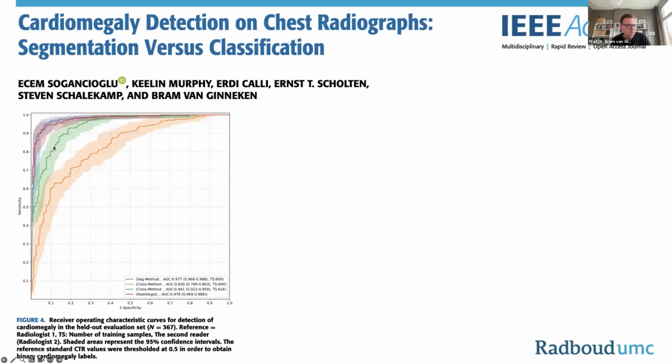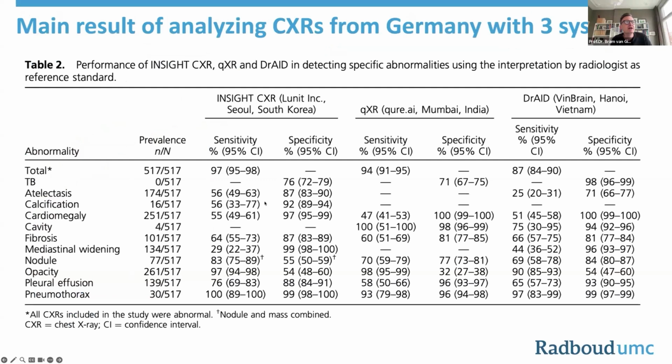And actually, I think, therefore, you have to be very careful if you want to find all these different abnormalities with a single network. But still, it is what these packages provide. And you have to realize also that for most abnormalities, you have either not too great sensitivity or not too great specificity. So if you run that on an X-ray, you will almost always find something, and it's actually likely to be a false positive.